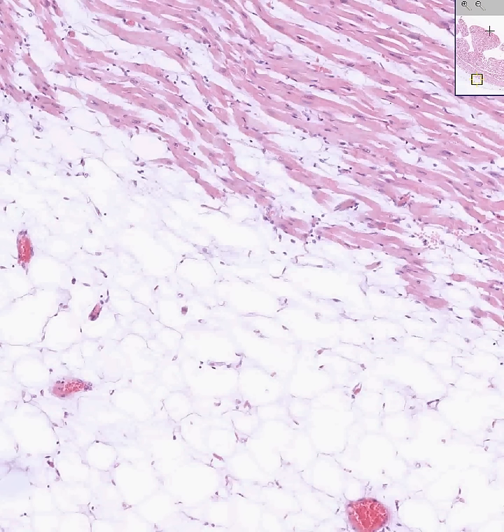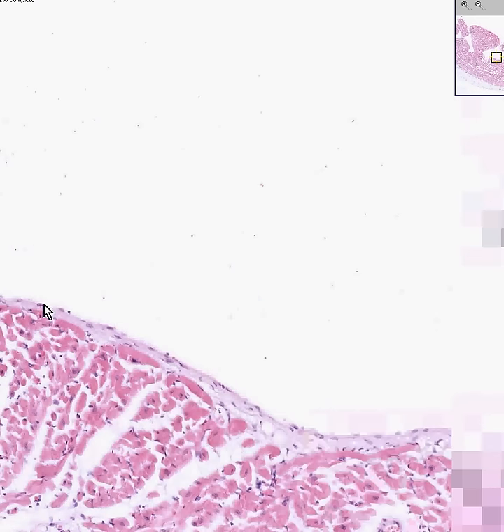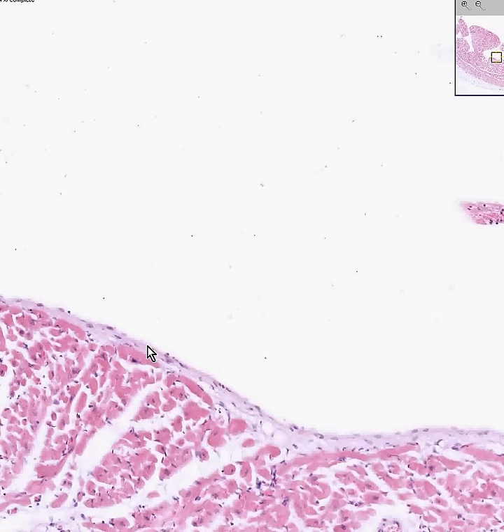Last but not least, this little layer of connective tissue towards the lumen of the heart, which can differentiate into heart valves, is the endocardium of the heart. And I thank you very much.